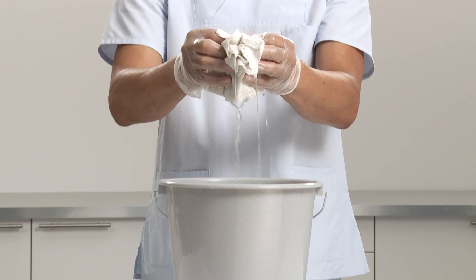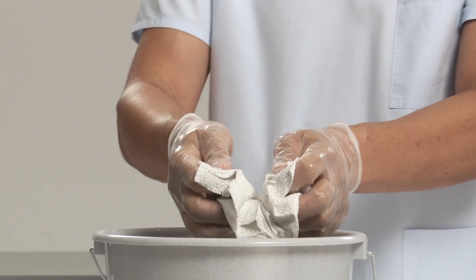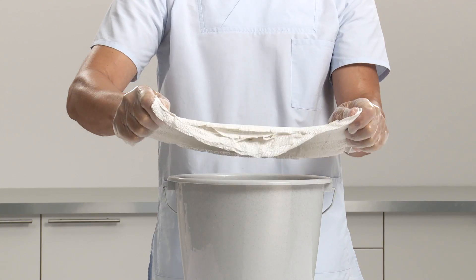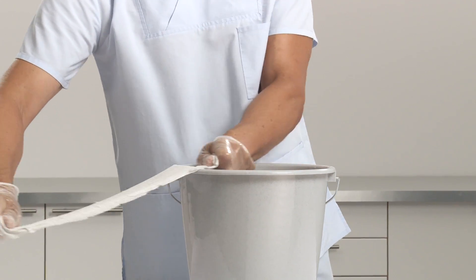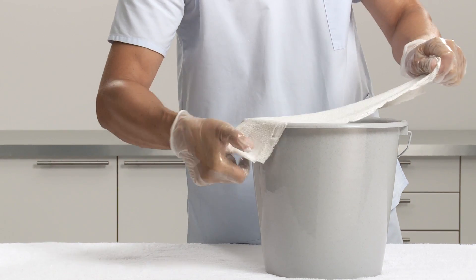Activate the splint by dipping into cool water, holding the ends and maintaining the splint fold. Remove from water and gently squeeze to drain. Straighten out the splint and run it over the edge of the bucket to smooth and dispose of surplus water.